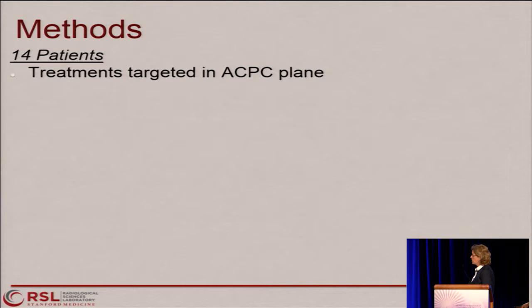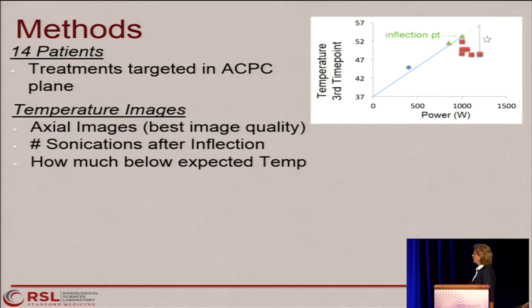So my methods are shown here. I looked at 14 patient treatments. These were all treatments that we were targeting in the ACPC plane. On the temperature images, I plotted that third time point as a function of power. I found the inflection point, and I counted the number of sonications after the inflection.